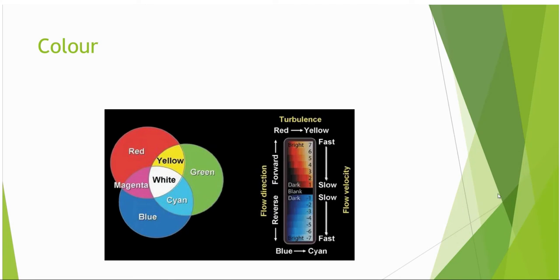The function allows for the overlay of green to the colour display. The combination of green and red makes yellow, and the combination of blue and green makes cyan. The brighter the colour at its extremes, the greater the variance.